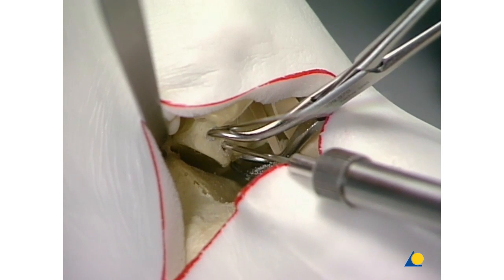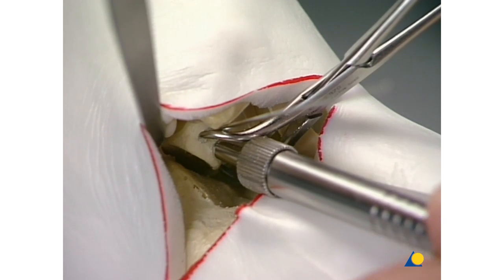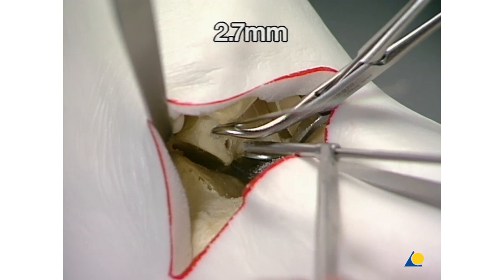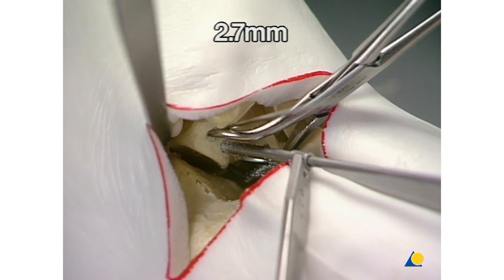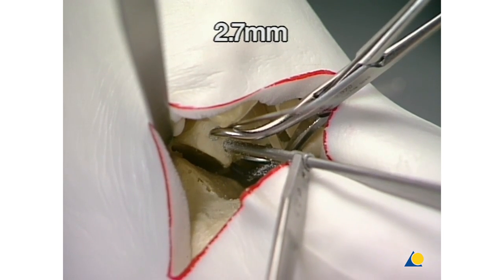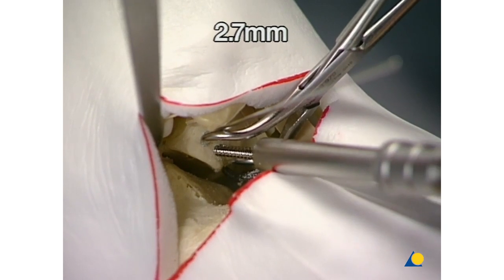Depth measurement. Creating the threads with the 2.7mm tap and insertion of the appropriate 2.7mm cortex screw.